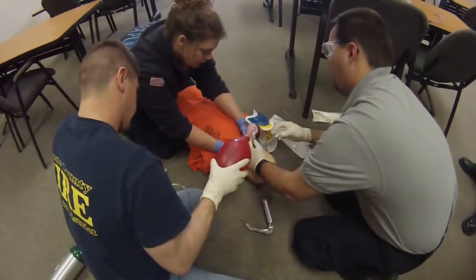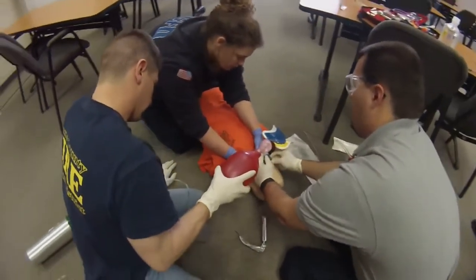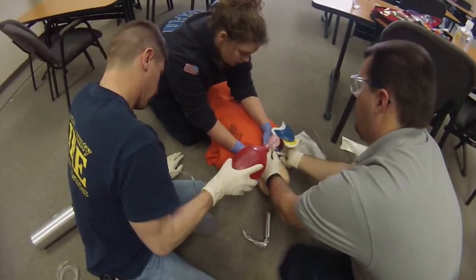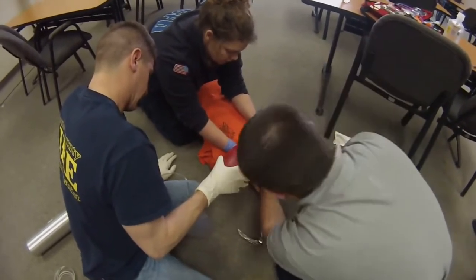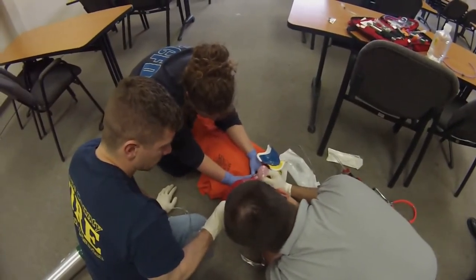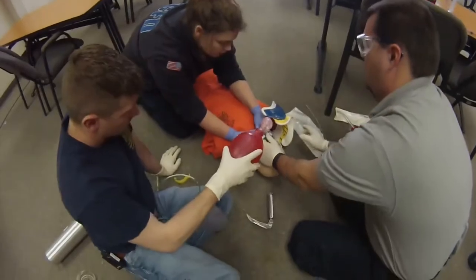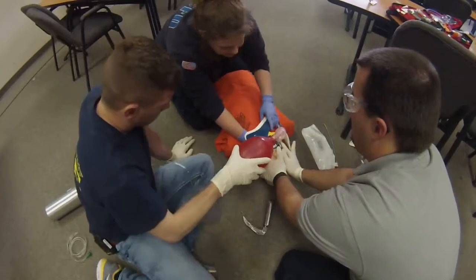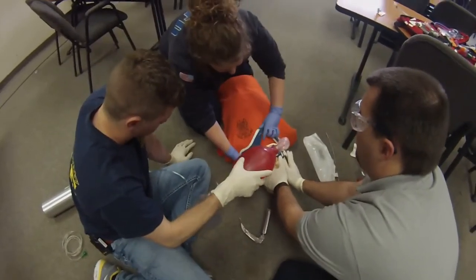Announce your depth so that more than one person knows — 21 at the teeth. And then what are you at the holder? 23 at the holder. Now you take back over, and she just replaces — just reversing what we did before.